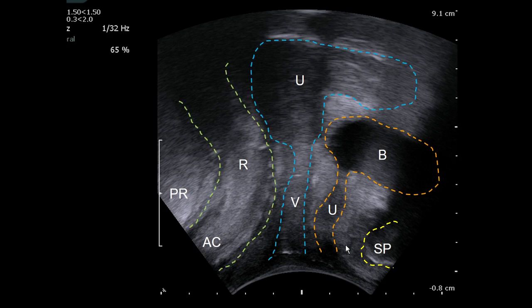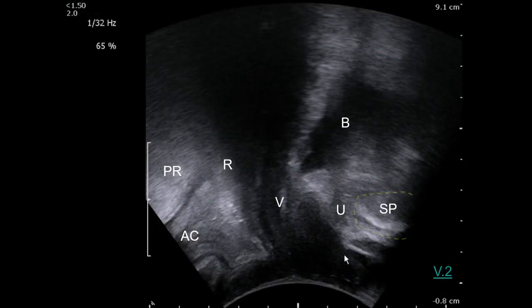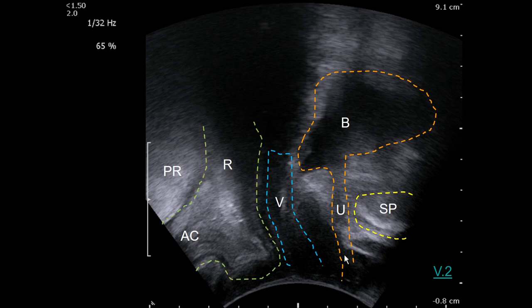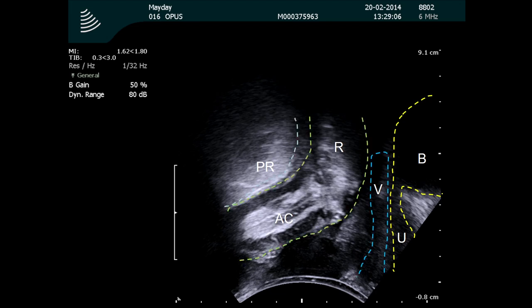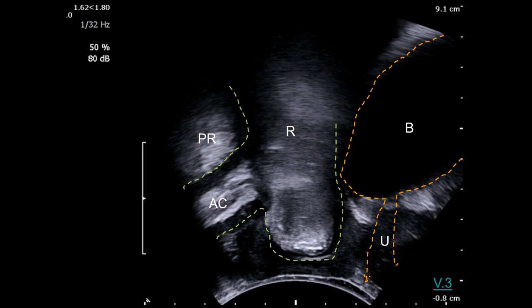Sorry, I cannot show you a video because five days ago my laptop was stolen — this was a disaster. But I can show you something interesting. At rest, you see symphysis, bladder, uterus with vagina, rectum, puborectalis behind. We ask the patient to do a Valsalva maneuver. The bladder is still there — no prolapse of the bladder — but look at the pocket and the prolapse of the anterior rectal wall. Another patient: ask to push again, and look at the rectal sac forming. The hyperechoic material inside the rectal sac is stool — this is stool trapping inside the rectal sac.